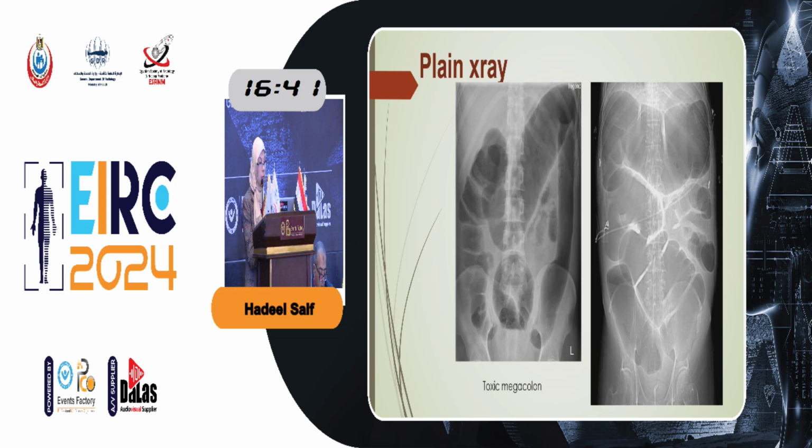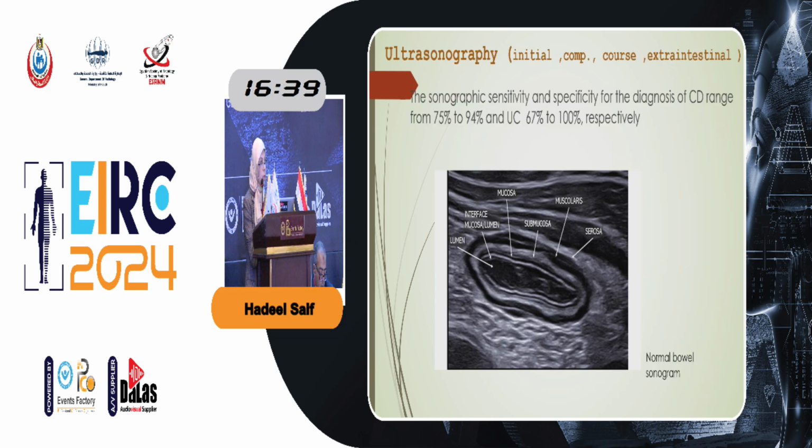And then we come to the ultrasound, which is a very important, very sensitive, and very easily acceptable exam to do in pediatric children. Believe me, I'm very close to the concept that there is nothing in the neonate or young children that you cannot see by ultrasound. The ultrasound is very sensitive and very informative. The resolution of the images is very fine and is also accepted by the operative team.